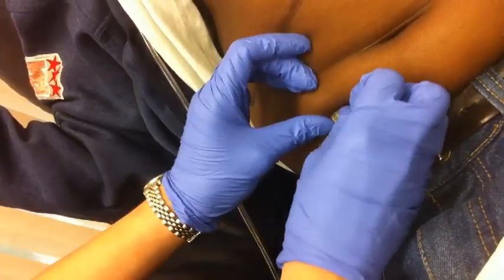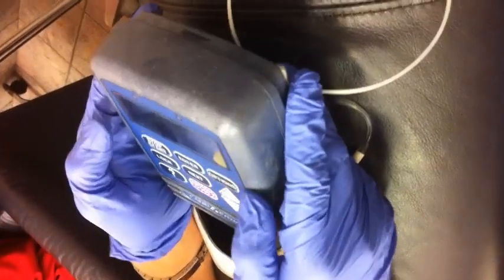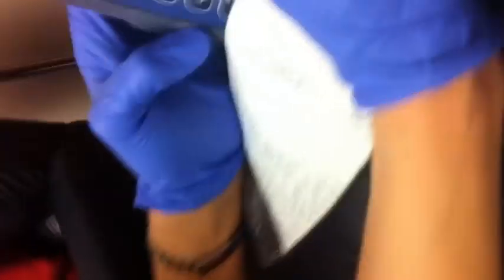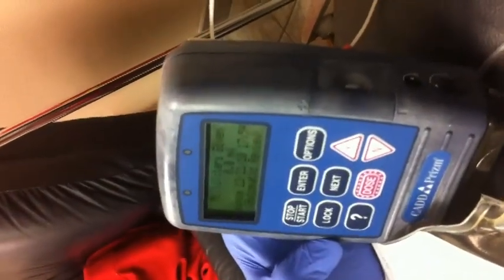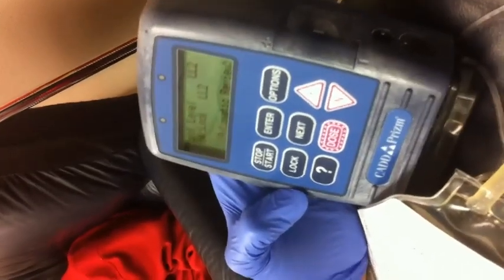Are you okay? And that's it, sir. What I've got to do is get one of your little thingies, but I want to start it. So now the pump is being started. I can make it nice for you. It says zero mL given, because it goes real slow.